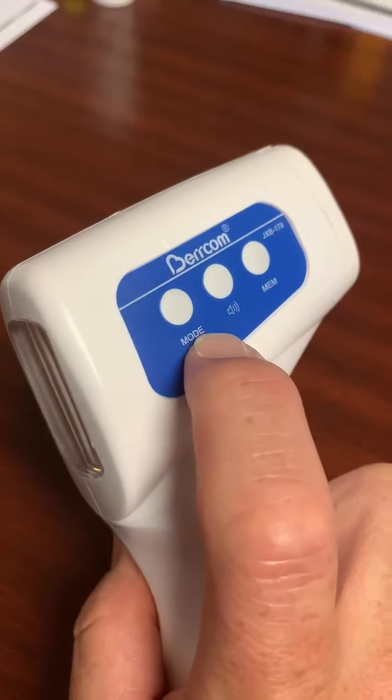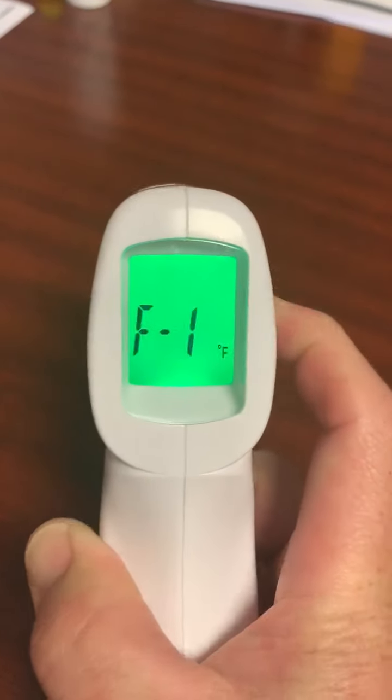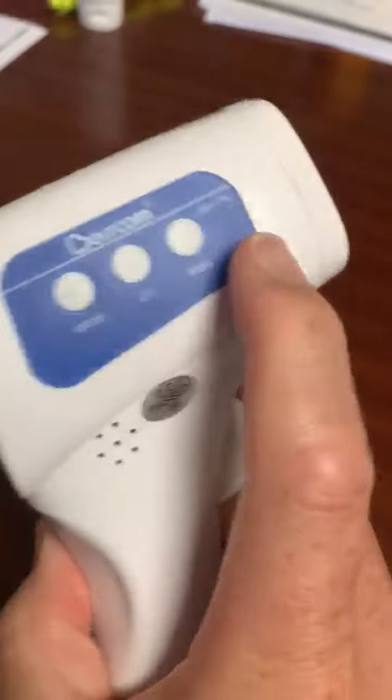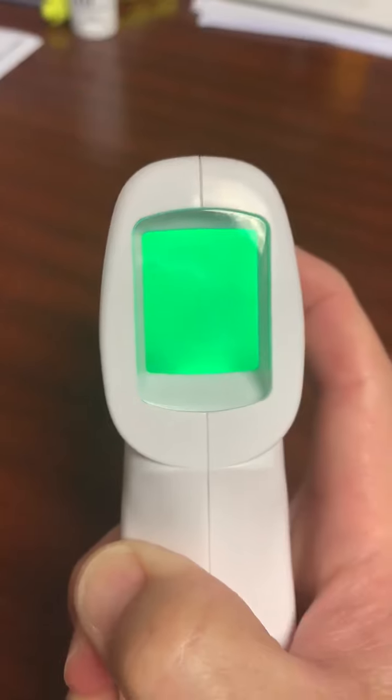I do so by holding the mode button down for two seconds and I see F1. Then I go back to the memory button, hit it one time, and it takes me to F2.